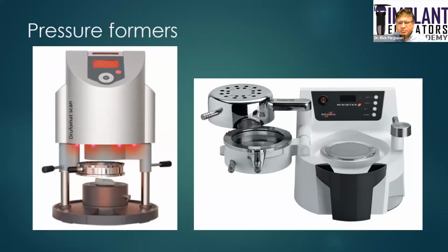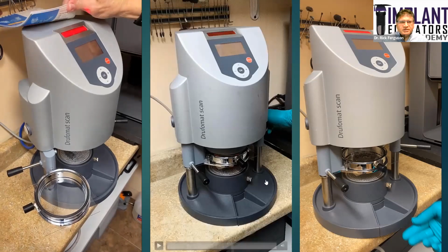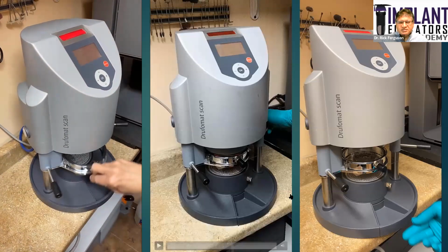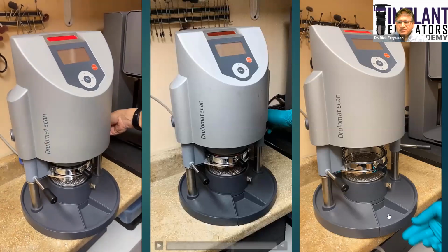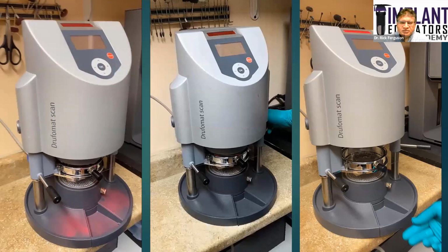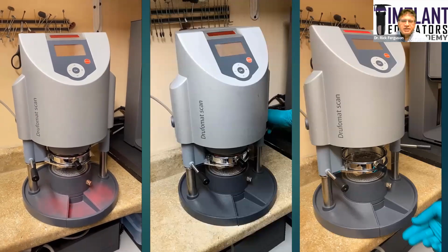And of course, we're using pressure formers because right now we still don't have the ability in office to print the aligners directly. All right, so we're using pressure forming. This is my dental assistant here actually making the aligners, and we have an assistant that is dedicated to doing this, by the way. We hired somebody pretty much just to do this. Now she does other things, but about half of her morning is spent making aligners, depending of course on the volume that you're doing, right?